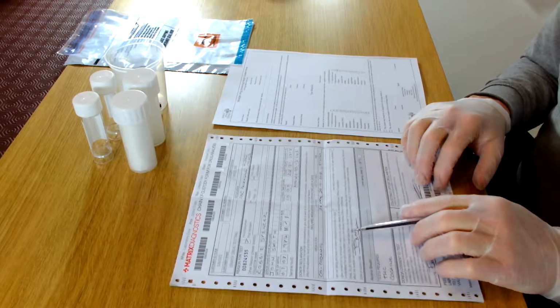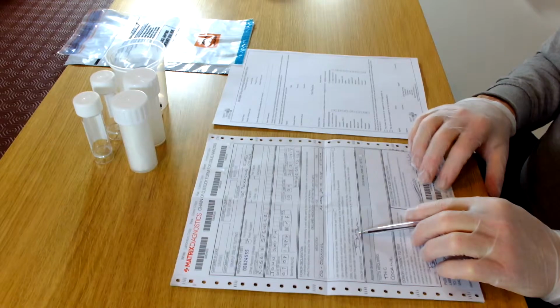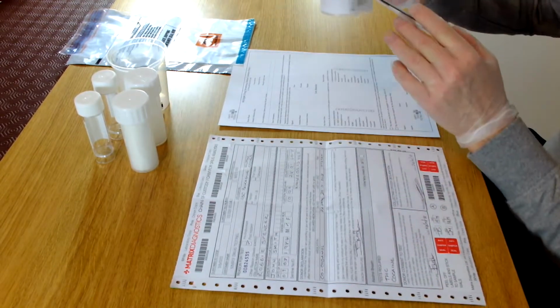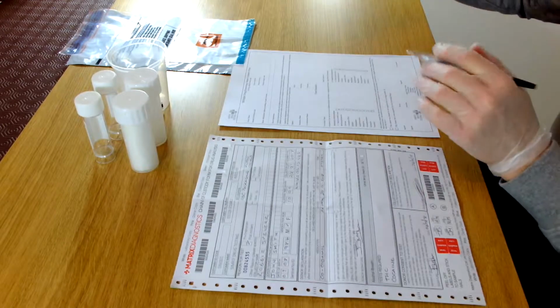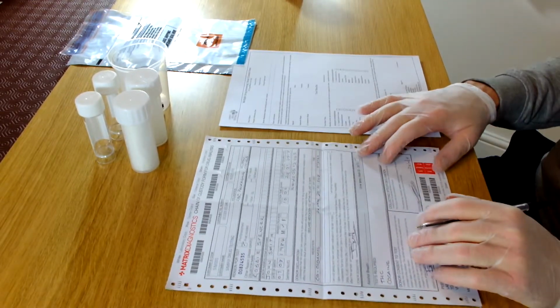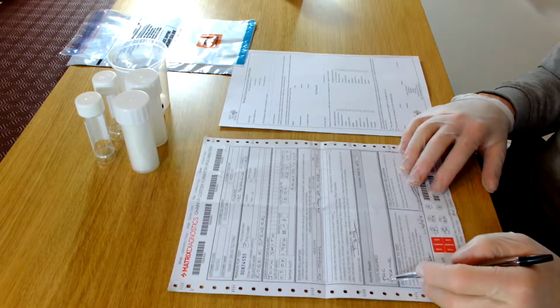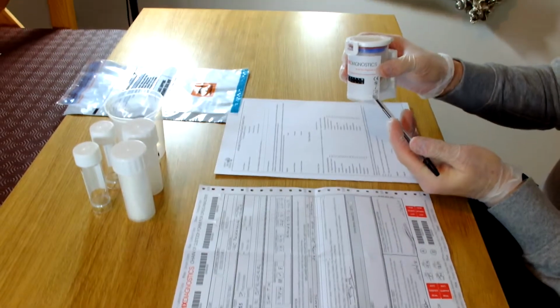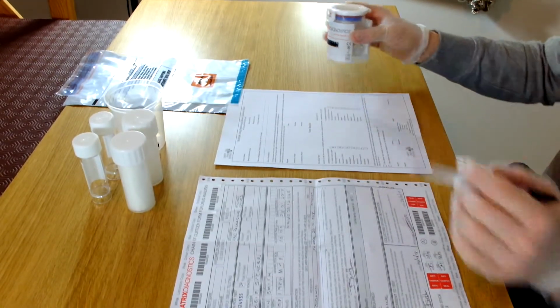The donor then signs the medication box, and underneath that we do a urine temperature check. If you've checked the temperature, which we did earlier on, and it was 32, I put a little tick in the box to say that the temperature was right. And then the test required. So if you have a non-negative result for, say, cocaine and THC, that's what you're going to put in the box there.